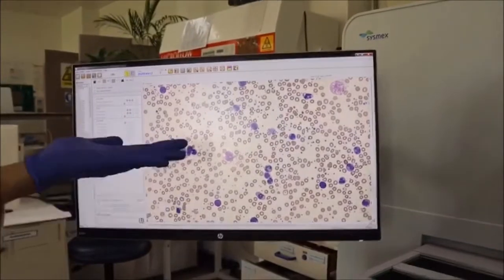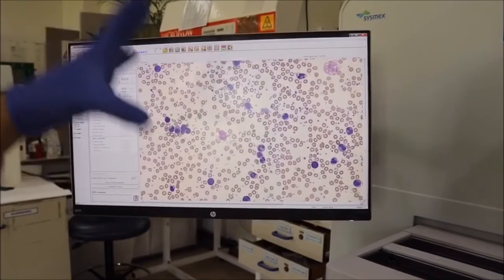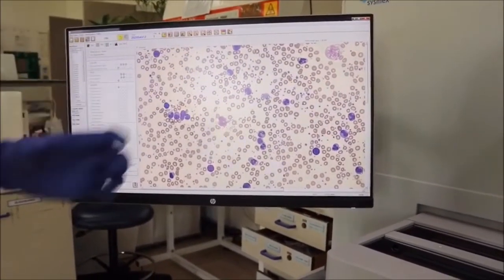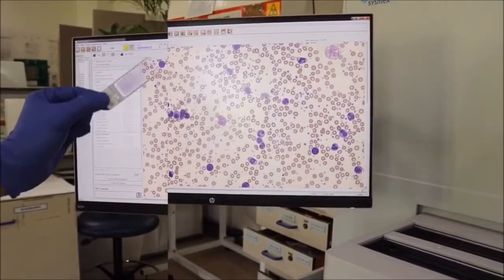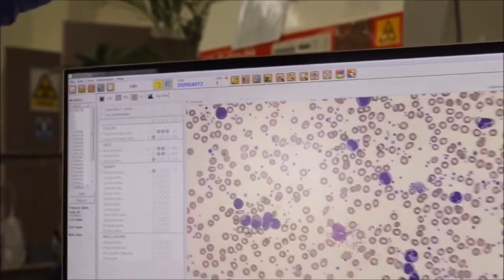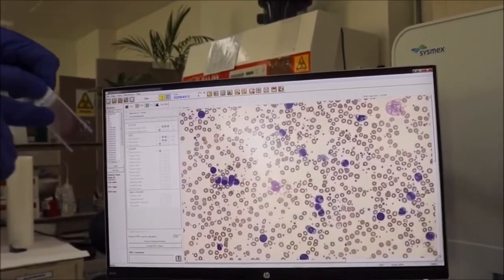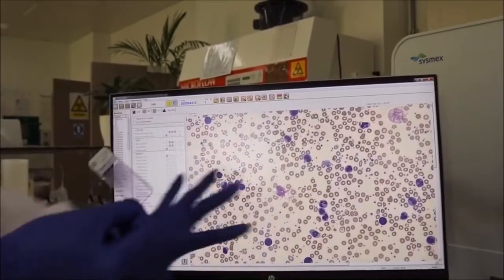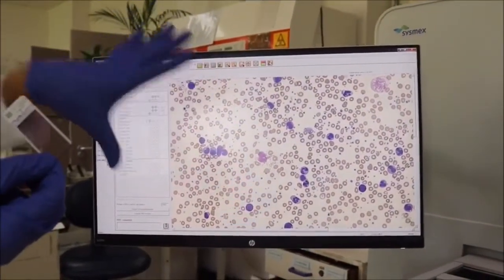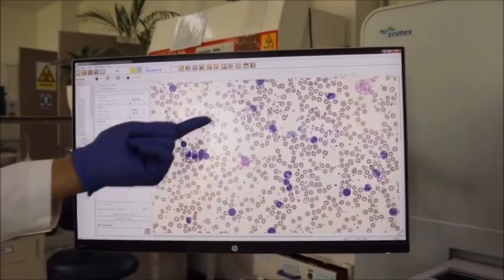This is now the initial blood film morphology that is processed by what is known as digital imaging technology, where that blood film that I have shown you earlier will be placed under a microscope that is built into this analyzer. It will capture a specific area in this blood film, and this is what it looks like, 100 times or 1,000 times magnified. And here you can see now the different cells of your blood.